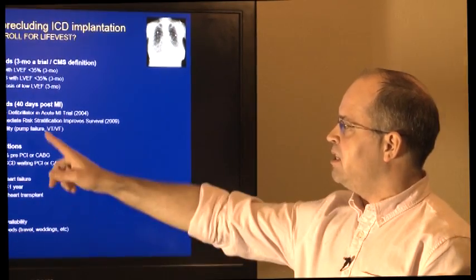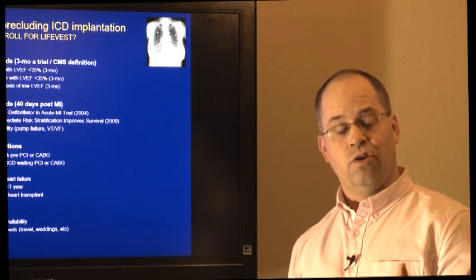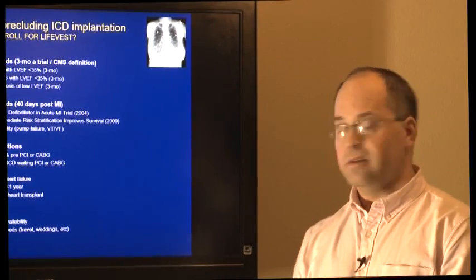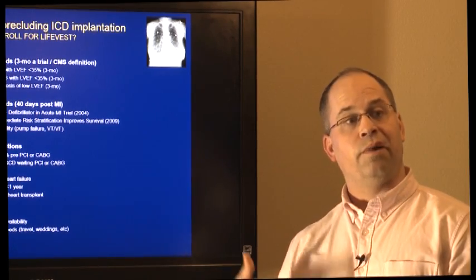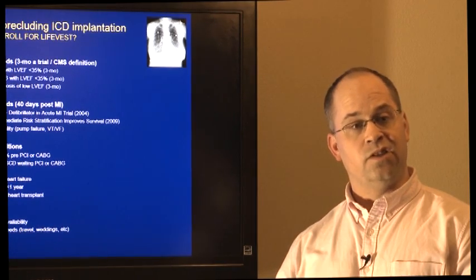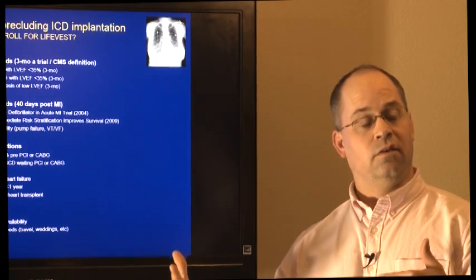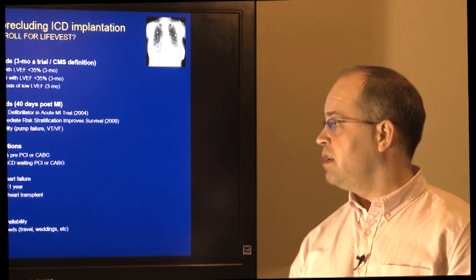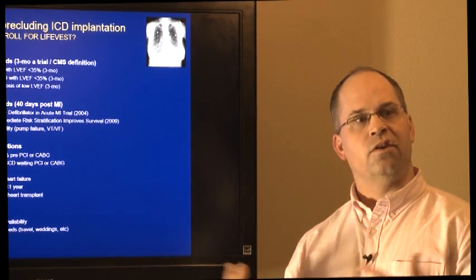So again, waiting periods post myocardial infarction. If you have an infarct, if your setting is acute MI, it has to be at least 40 days. And that's the result of 2 trials completed in 2004 and 2009, which showed no benefit to an implantable defibrillator in that early period. And why? Because in those populations, a certain number of people, having just had a myocardial infarction, in fact, died of pump failure. The myocardium failed in the setting of a heart attack, such that the ICD did not have a mortality benefit in the entire cohort.